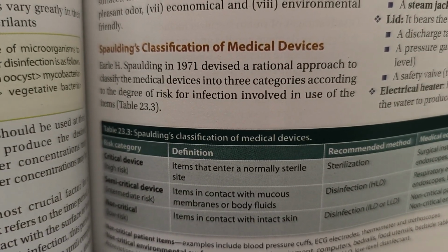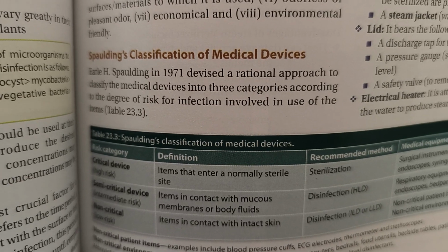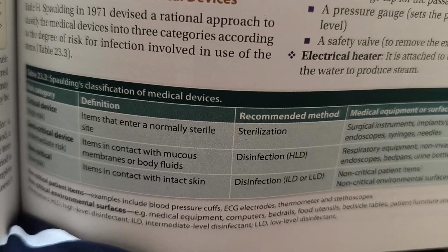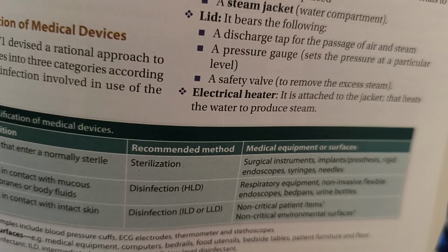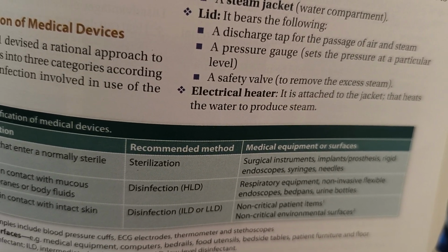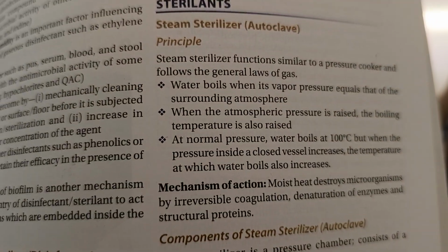Non-critical, low-risk category includes items in contact with intact skin. Here, intermediate or low-level disinfectant methods are recommended. Non-critical patient items and non-critical environmental surfaces are the medical equipment.